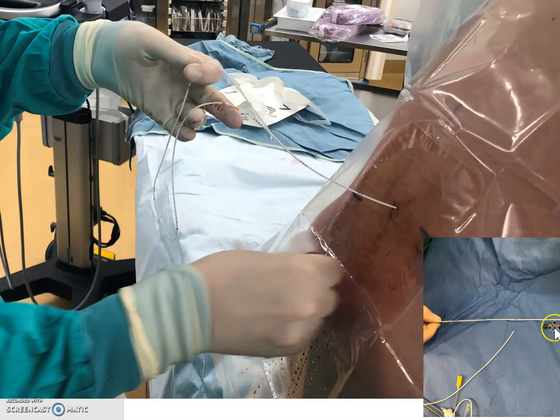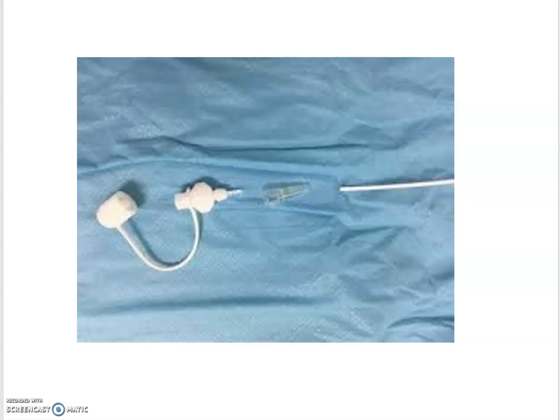As mentioned before, the markings are not like the epidural markings. If you hit the space at about 6 centimeters and want about 5 centimeters in the space, you're going to be here between the first and the second marking. The next part is to assemble the catheter connection piece that will hook up to the spinal drain.